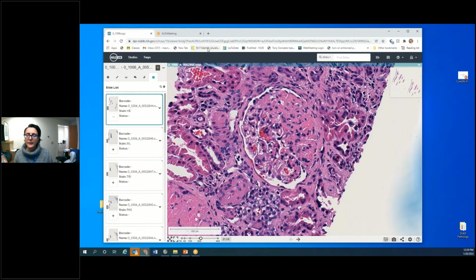I have a question about that, Laura. So I understand that you're marking the specific location and that you get back to that specific thing, but how is it determined what you called that lesion? Because for some lesions, there might be differences of opinion on how we label them. So how is this labeled? It will be recorded in the CRF. So there is no labeling of all slides. This is just marking the site. It's not saying why you're marking it. Yes, this is marking the site.